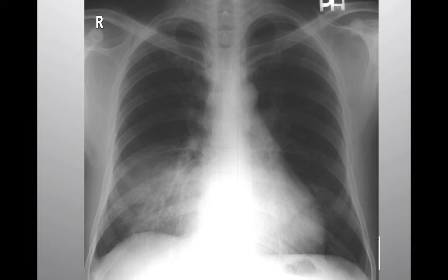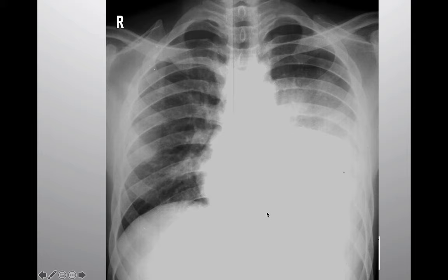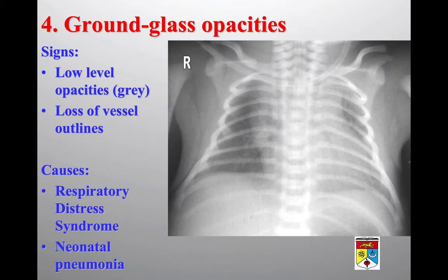If the left mediastinal border is lost, the pathology or consolidation is in the left upper lobe — and not the lower lobe, because the left hemidiaphragm is still visible. If the right heart border cannot be delineated but the left heart border is clearly seen, the consolidation is in the right middle lobe, as the silhouette between the right middle lobe and right heart border is lost. Loss of the left hemidiaphragm outline indicates left lower lobe consolidation; if the left heart border is also lost, the lingular segment of the left upper lobe is additionally involved.